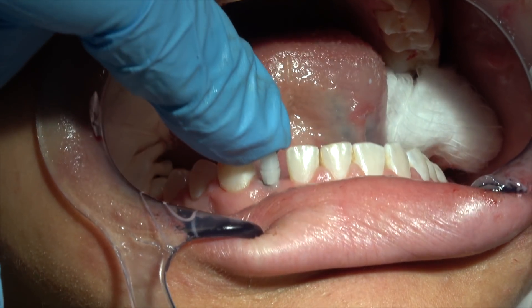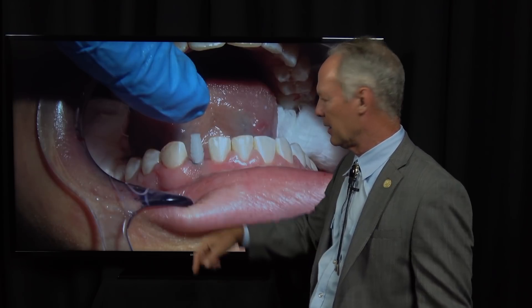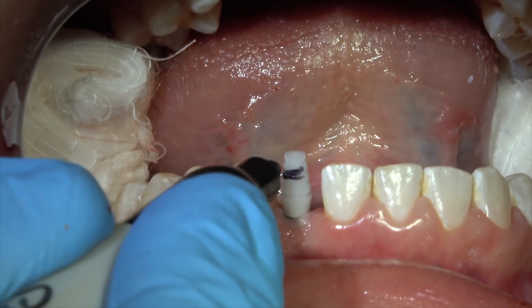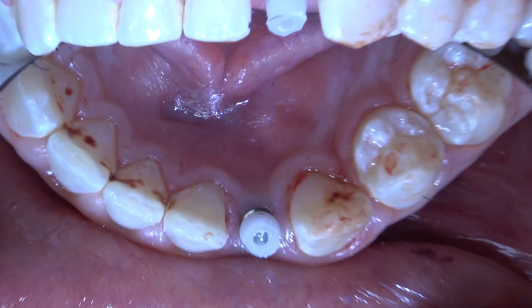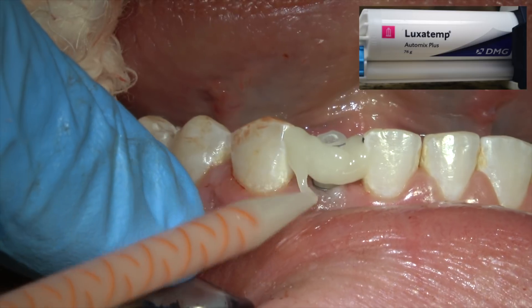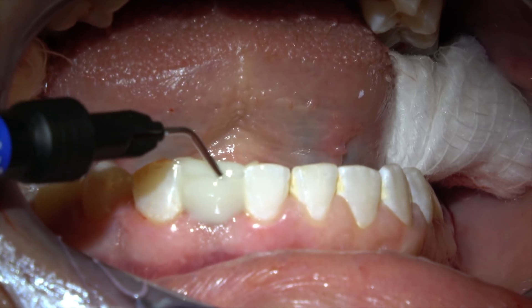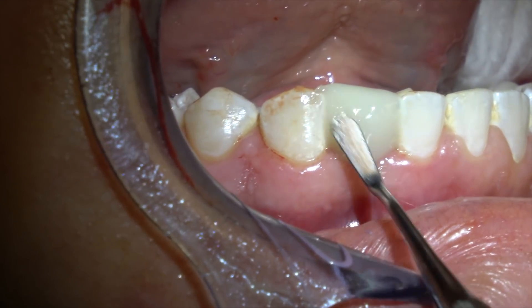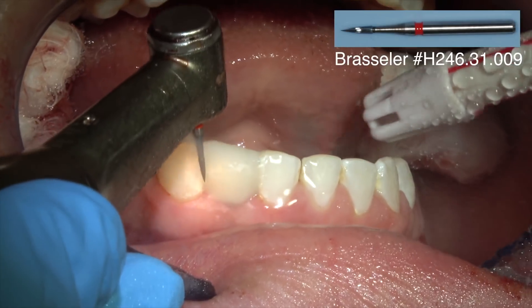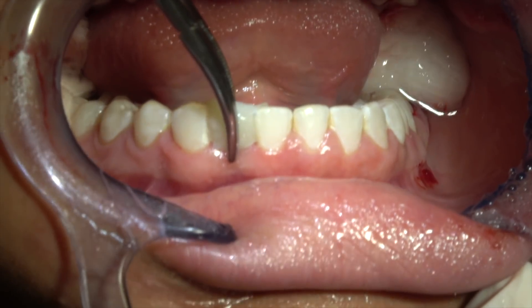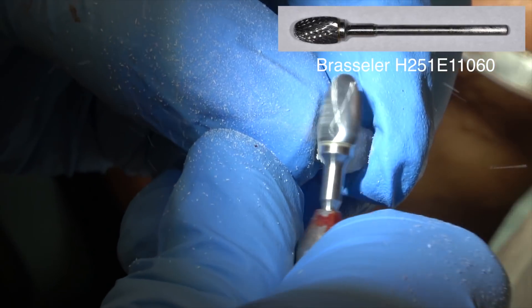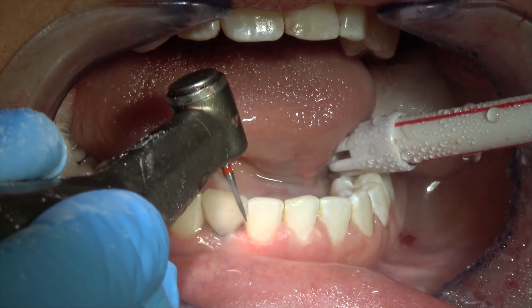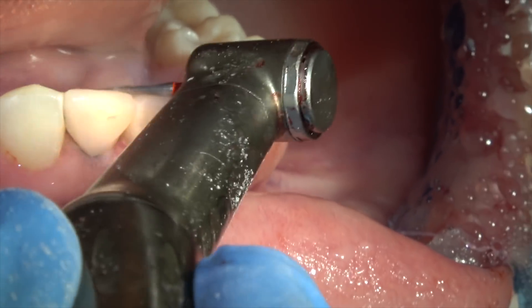This is the provisional coping. I'm going to fabricate my provisional restoration on this coping. You don't have to cement it — it snaps right down. I'm putting it to place, marking it, cutting that off, then snapping it back on. I squirt bisacrylate around it, contour that in while it sets, then come back with flowable Filtek composite, contour that in, and cure it. Then contour it with a 12 or 30 fluted bur, take it off, and trim a little bit more with an acrylic bur. This work is so much fun if you've got the time — but if you've got three patients waiting, you won't like it at all.